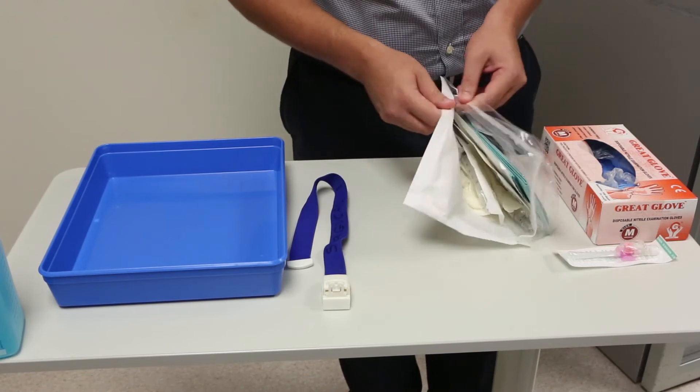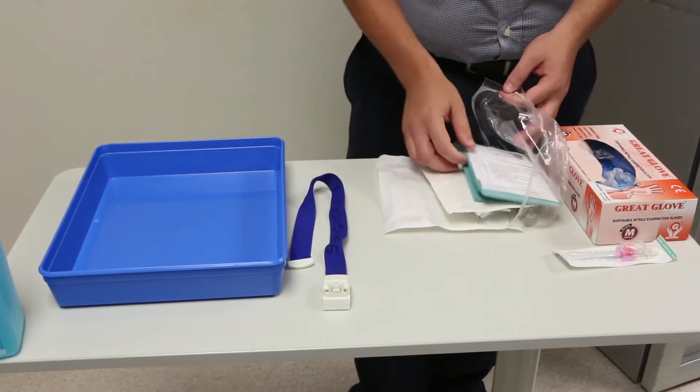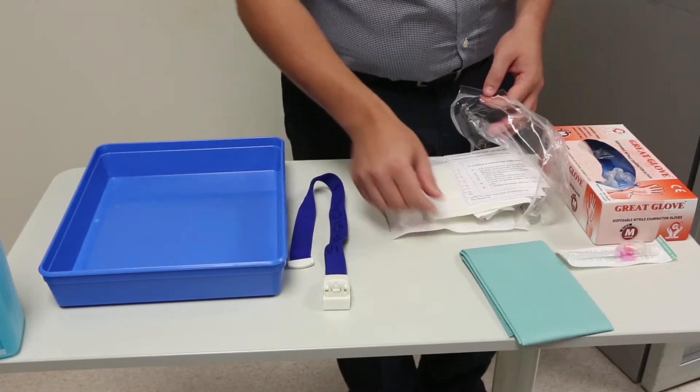Step 4. While the tray dries, collect all necessary equipment and place close at hand next to the tray.